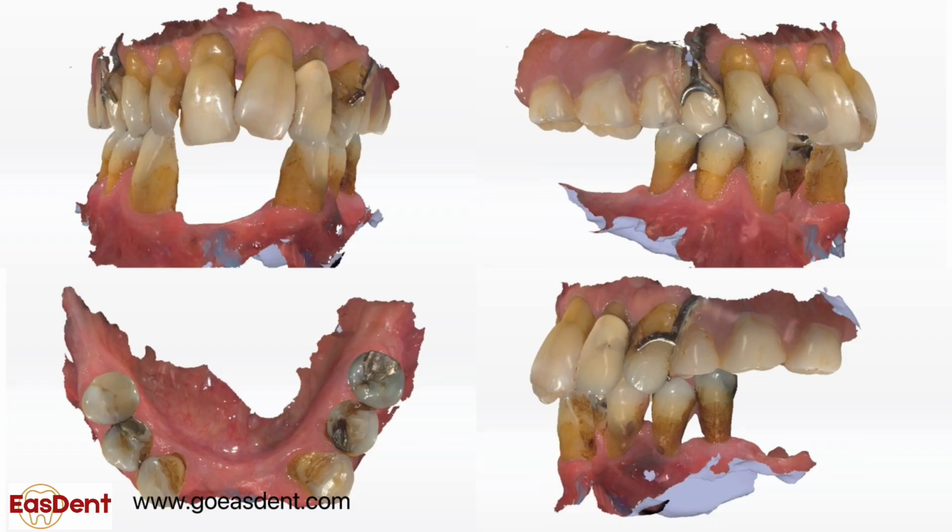For removable partial dentures that rely on support from both teeth and soft tissue, especially the partial dentures that have distal extension, the intraoral scanner cannot capture all the tissue border. Impression is necessary to help catch the soft tissue border for the dentures. However, intraoral scan can help increase the accuracy of data collection, reduce the chairside time, and the number of visits.